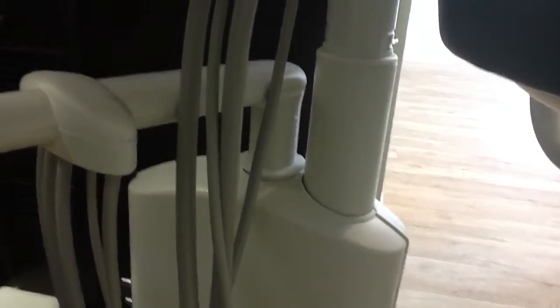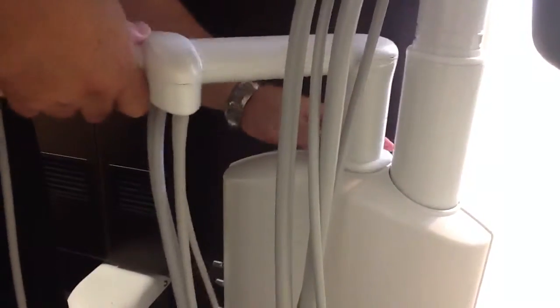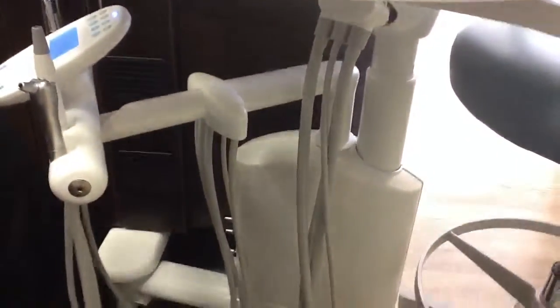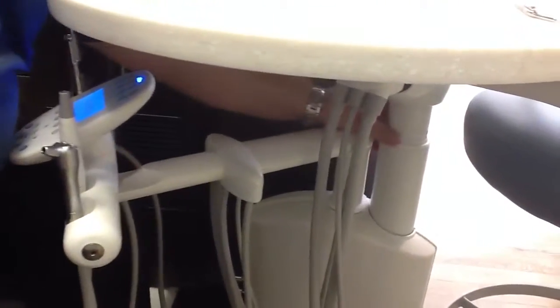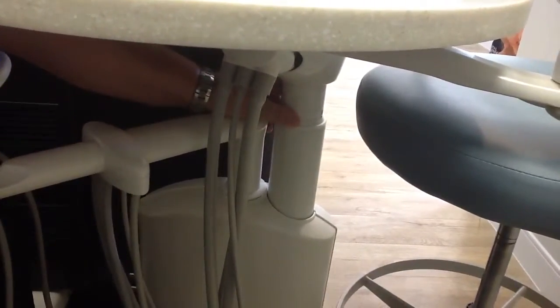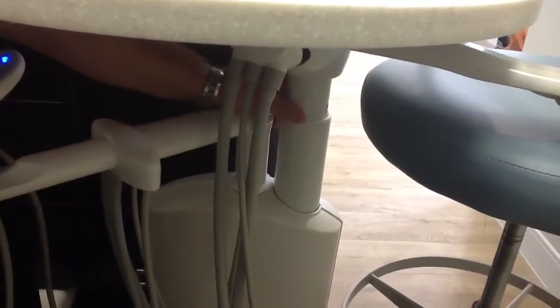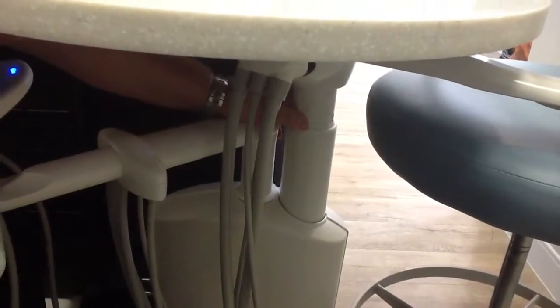Okay, and so we can go ahead and move that back to where it was. How do we do that again? All you do is you lift up, you slide this down, and you're ready to go. Okay, that's easy. And the same thing can be done with this assistant side. If you notice this ring where my finger is, you would lift up on this work surface. A little bit tougher to do because of the weight, but the same idea behind that.